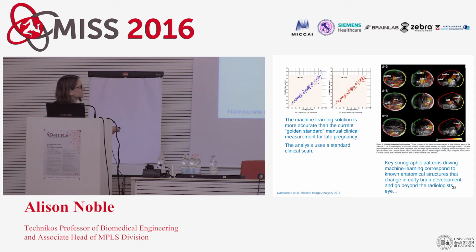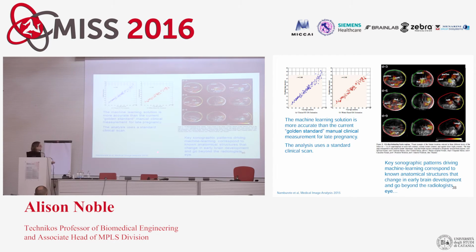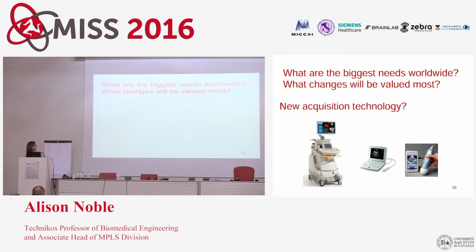So what we were starting to do, which I think is quite interesting, is from an ultrasound point of view, recognize patterns in these scans that radiologists could not recognize. So start to get information out that goes beyond the radiologist's eye. So that's some of the work we've done on the fetal.